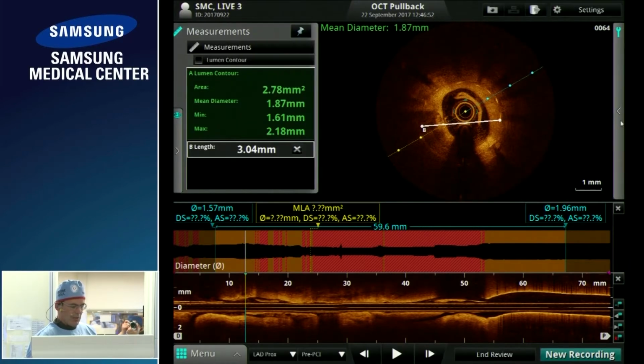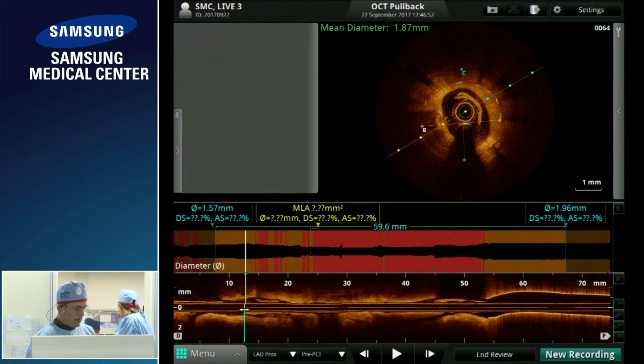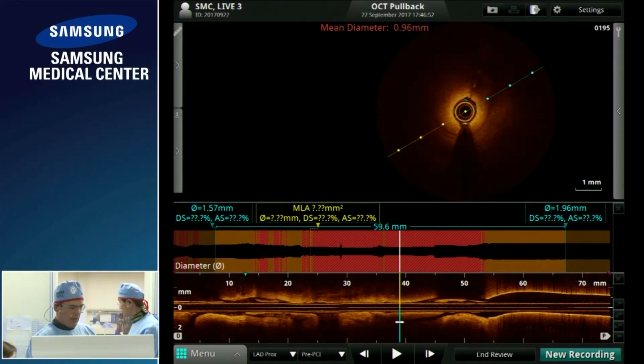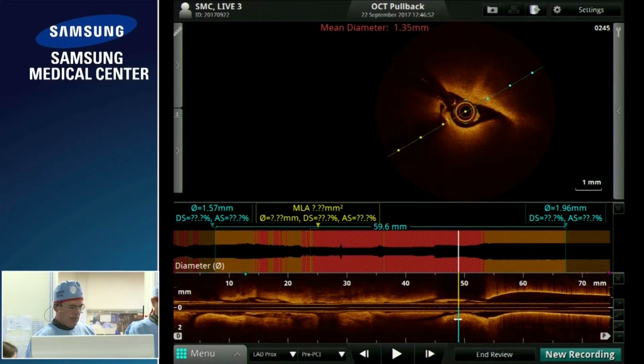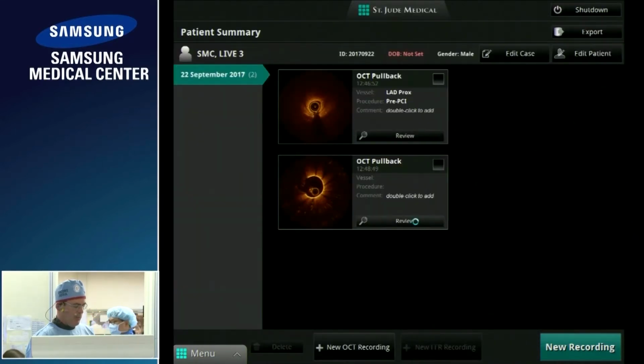So that's 3. But if you're looking at the vessel size, it's clearly significantly over 3.5, that vessel. We'll get some more information more proximally. So this is not good clearance within the segment, so in terms of the diagnostic information, limited. So I've got a little bit of information there, but that's because we haven't done any ballooning within the LAD segment, only with a 1.5.